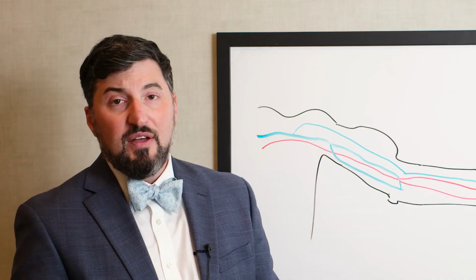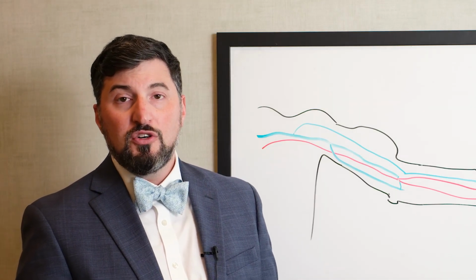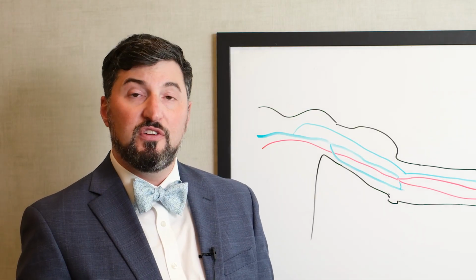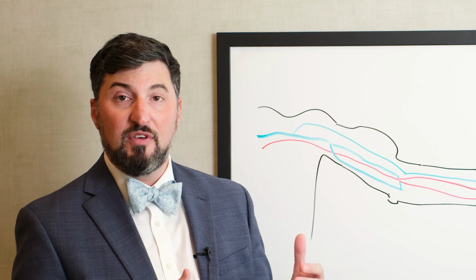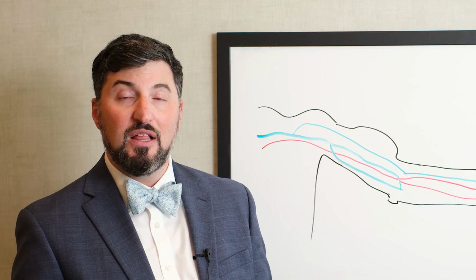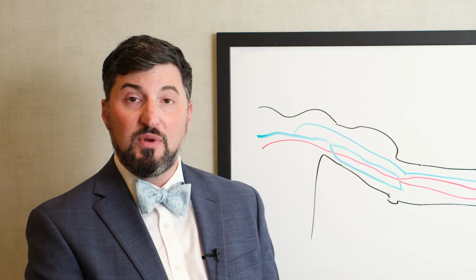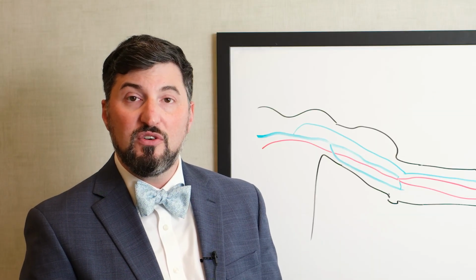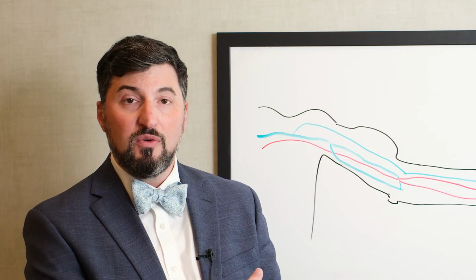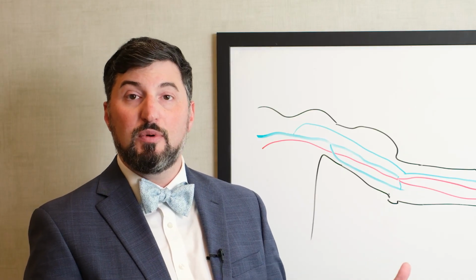The other downside of a graft is that even though it's really easy to get up and running early on, long term, it's a little bit harder to keep open. Grafts don't stay open as long or as well as fistulas, but that's okay. We pay attention to that with ultrasound, and if we see that you're having problems on dialysis, or if we see that there's lower flow through the graft or there's an outflow narrowing that we need to deal with, in literally a couple minutes in a minimally invasive procedure in our outpatient center, we can poke into it, get a wire through that narrowing and balloon it open, help maintain patency or keep it open.